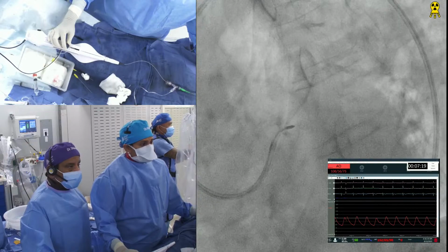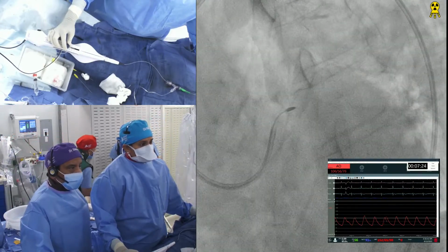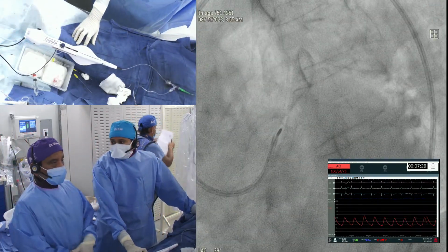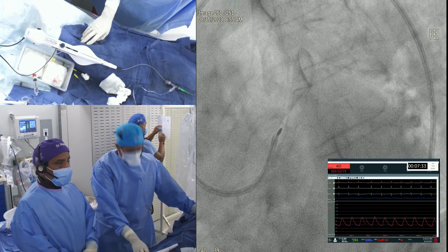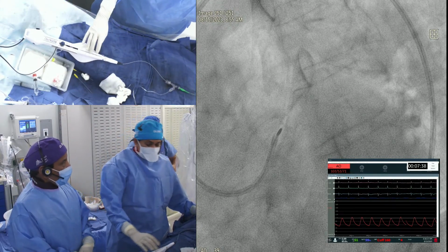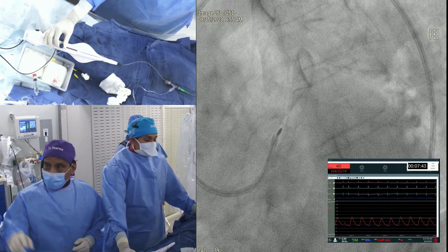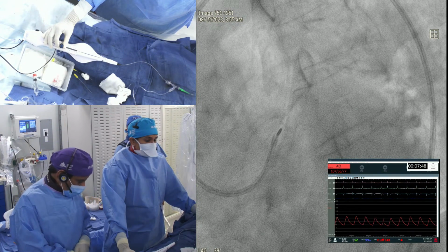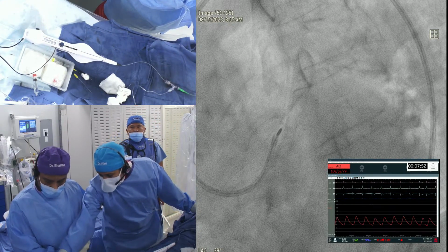No, I think we should not. That's it. Why? It's hitting the roof of the normal vessel. Proximal circ. You want to go to 130 speed, very low? Okay. Yeah, we can do it manually. You are going to go to 130. So the less injury and more flexibility. A lot of people try to do this with a low speed. What do you want?